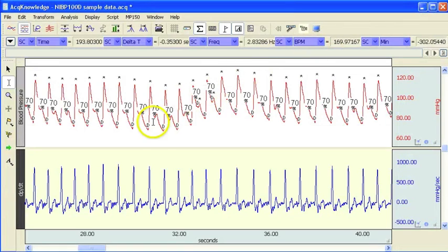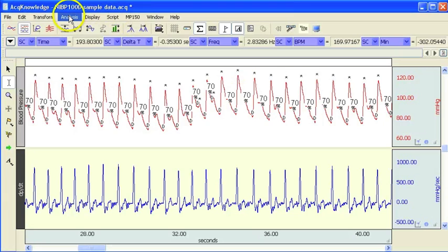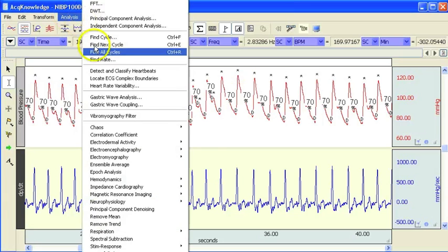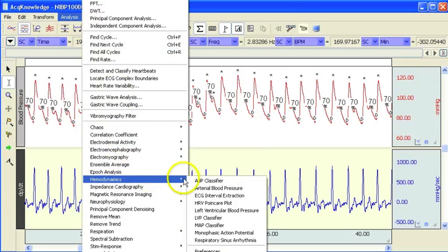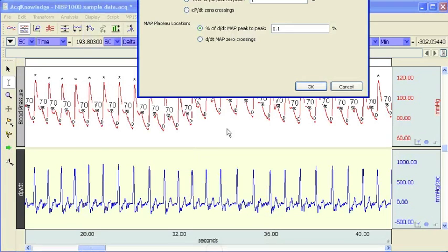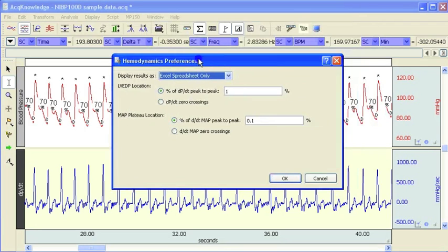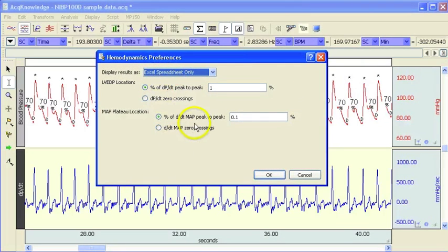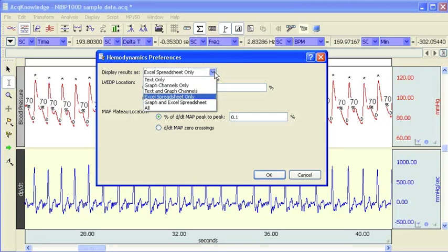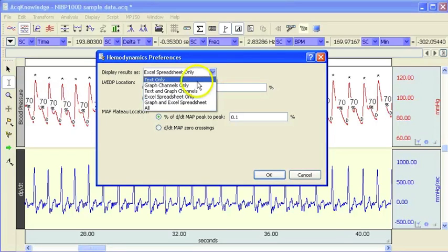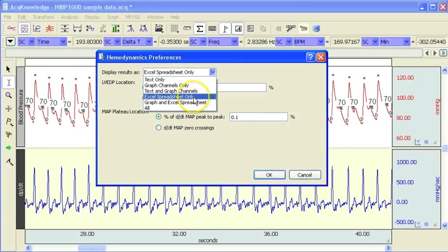So it's a very straightforward way of extracting the values. If we come back into the analysis menu and go to the preferences, as with many of the analysis routines that we run, there are a couple of options here. This first one allows us to decide whether we want to get the values in the spreadsheet, text only, or through Excel.